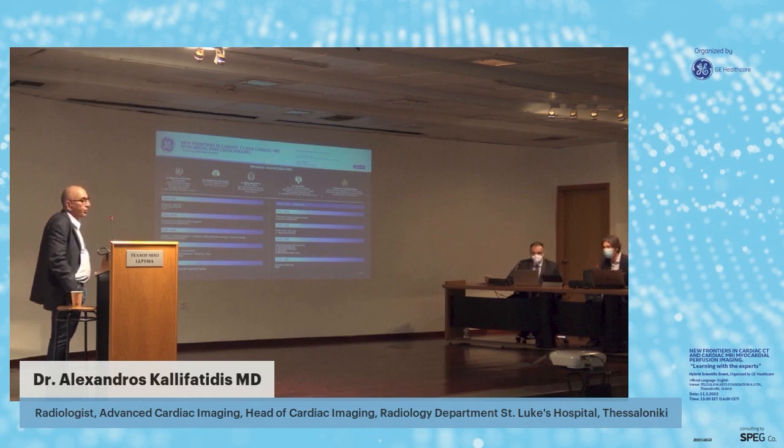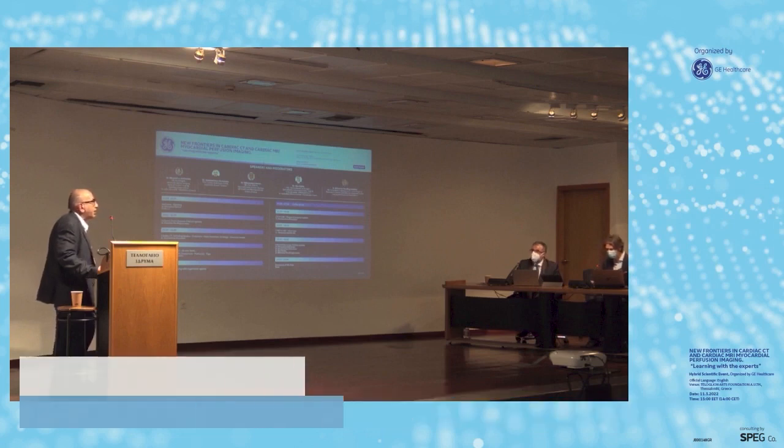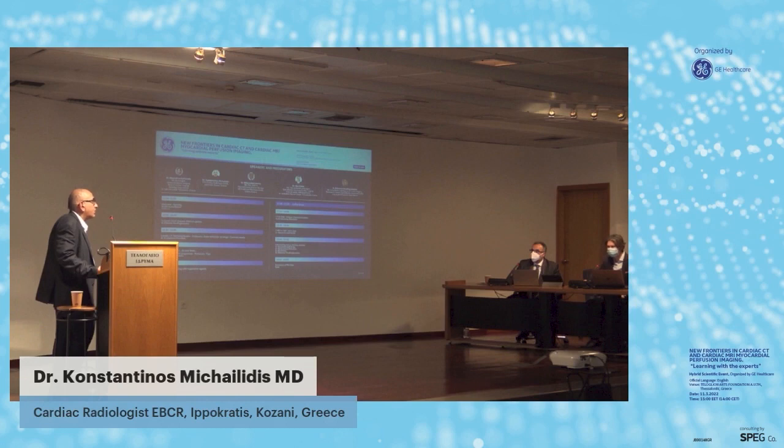Do you suggest using this classification in order to have a common language with the referring physicians? Of course, I think you cannot utilize coronary CT angiography if you don't produce a clinically useful report, and of course CAD-RADS is the cornerstone of that. I think you cannot report coronary CT angiography if you do not mention CAD-RADS at the end. It's the same thing as doing mammography without BI-RADS.